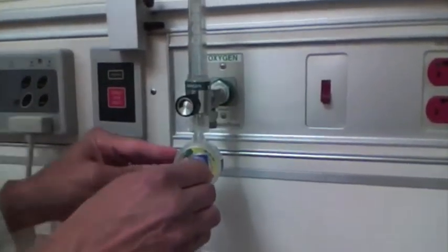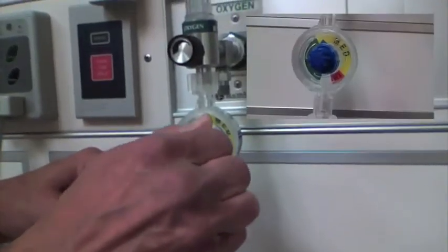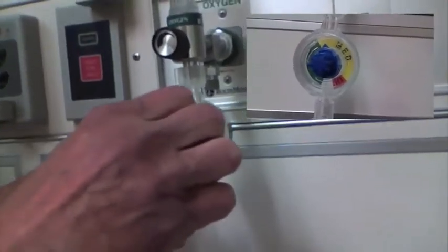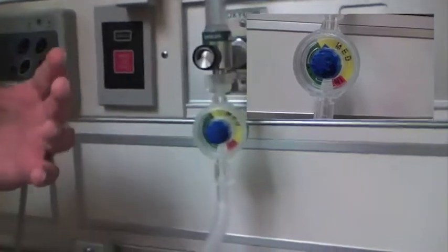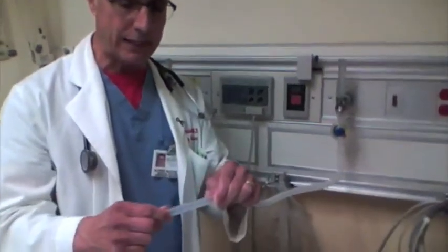This knob here controls how much pressure you're going to give the child. In adults, you're mostly used to bagging them with an amount of volume — you put someone on a ventilator and say you want a tidal volume of 450 or 500. In children, you don't do that, because if you look at volume, a lot of it goes into just extending the tubing. The child's got such small tidal volumes that unless you have very rigid tubing, all you're going to do is ventilate the tubing. So the way you do it is by pressure.